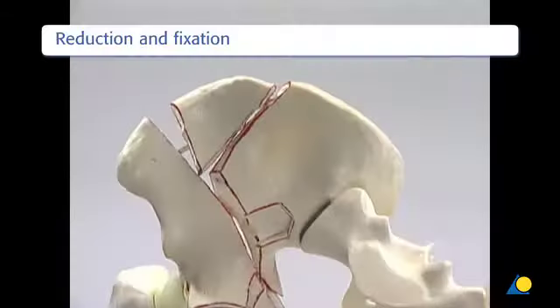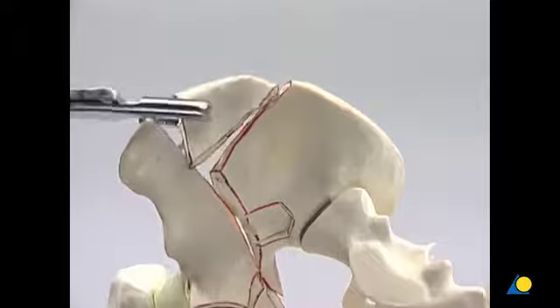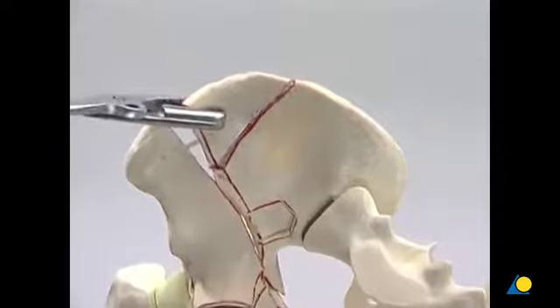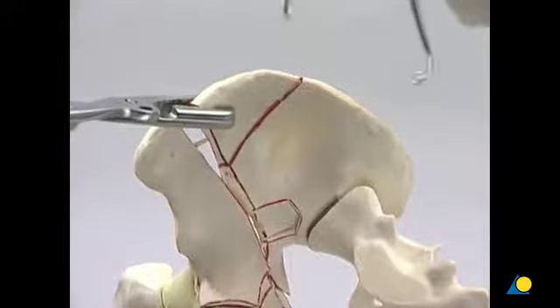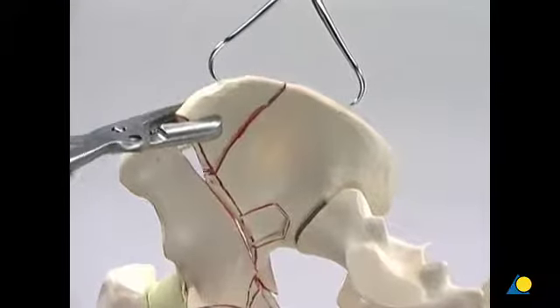The anatomical reduction starts at the proximal aspect of the iliac wing. It is important to restore its normal curvature. A Farabeuf clamp is used to reposition the free fragment of the iliac wing. The pointed reduction forceps is applied to reduce and temporarily fix the iliac crest.